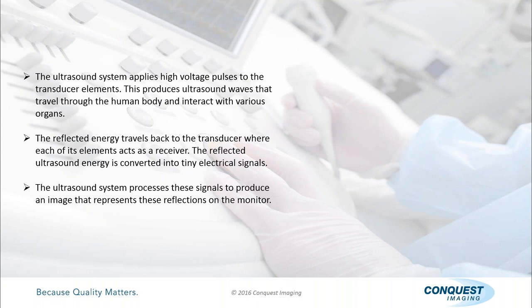So, how does ultrasound really work? Well, they apply a high voltage pulse to the transducer element, and this sends out a sound wave that travels through the human body. It interacts with various organs, and then the interactions cause reflected energy to travel back to the transducer, where each of its elements acts as a receiver, and then they convert these signals into tiny electrical pulses, and then they're processed and displayed on the monitor.